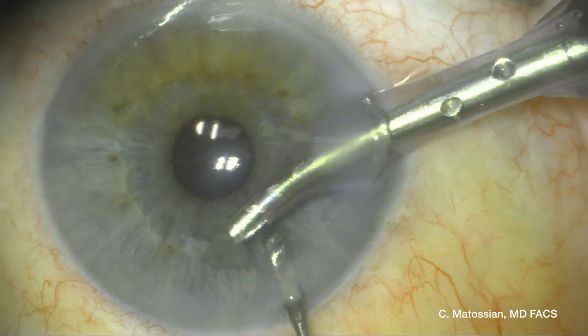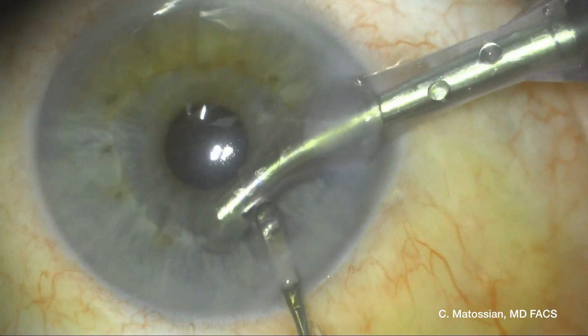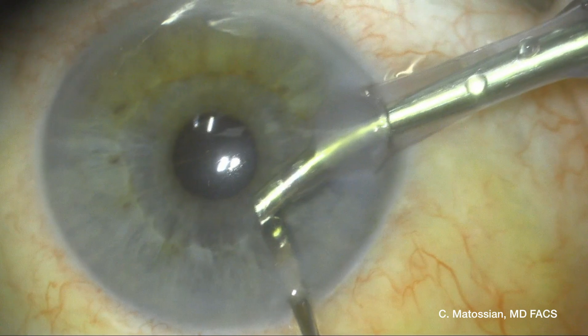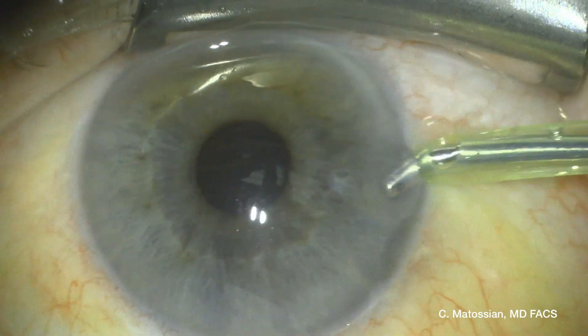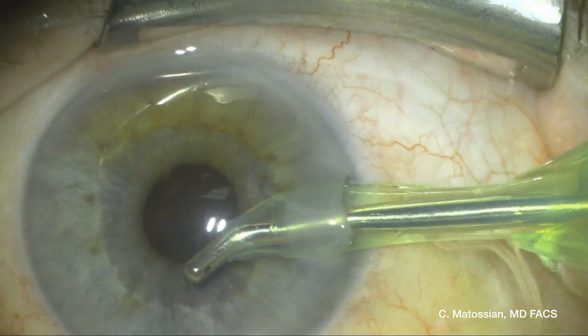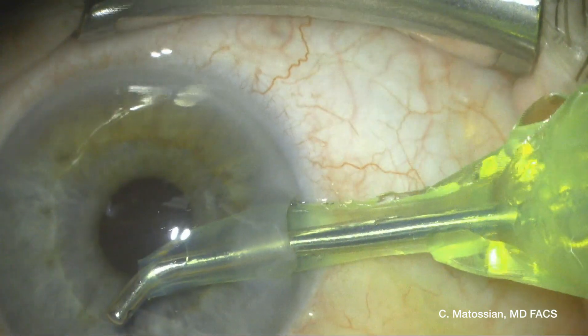With the irrigation aspiration system, which I'm about to use, I'm making sure all of the viscoelastic is removed from that area of the anterior chamber. I'm also going to spend a little time vacuuming that area to make sure there are no small fragments of the nuclear fragment stuck in the angle.